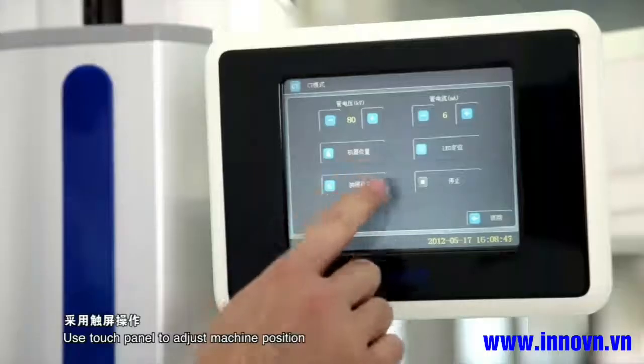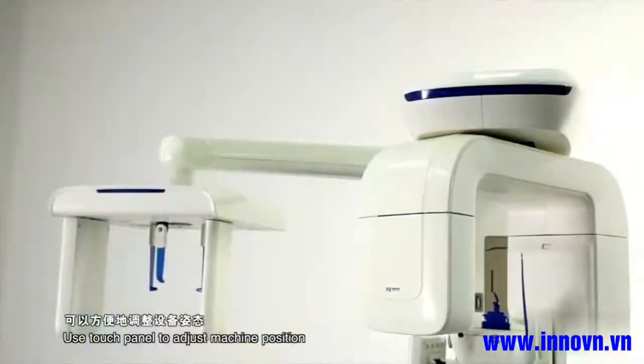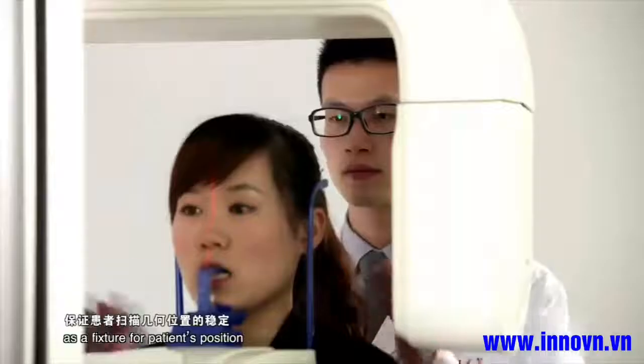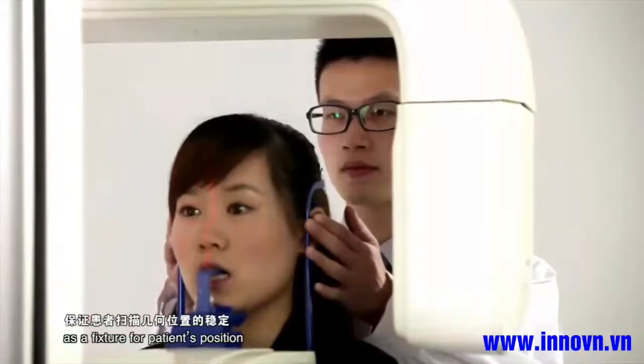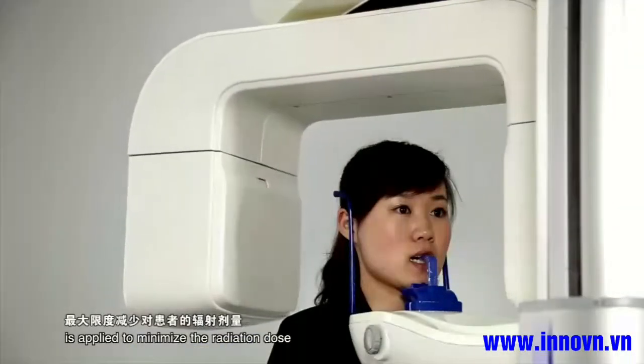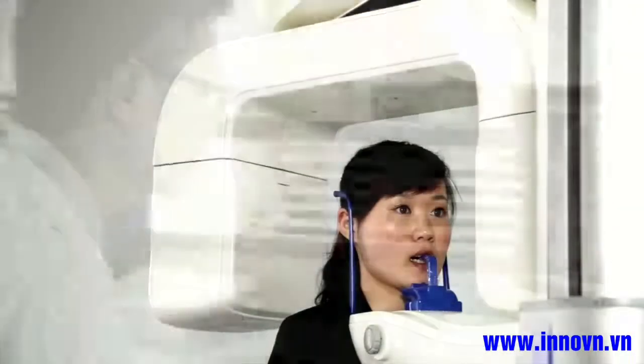Use the touch panel to adjust the machine position. Chin support, front teeth bite and dual beam laser serve as a fixture for the patient's position. Pulsed radiation technology is applied to minimize the radiation dose.